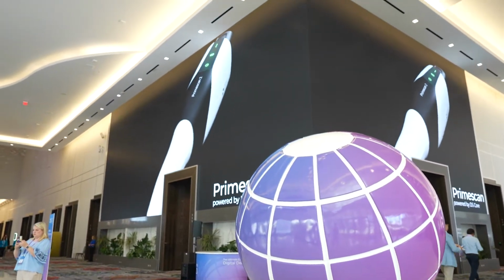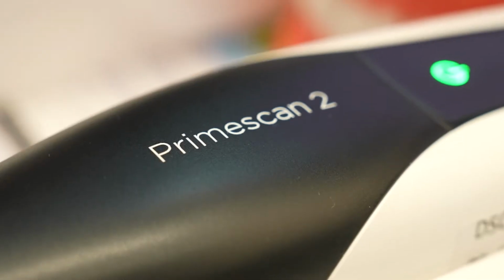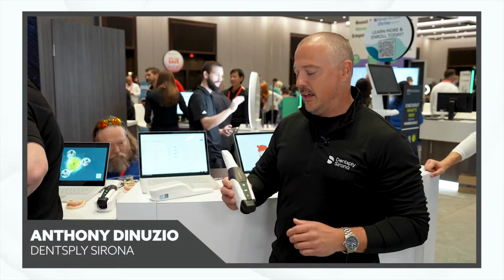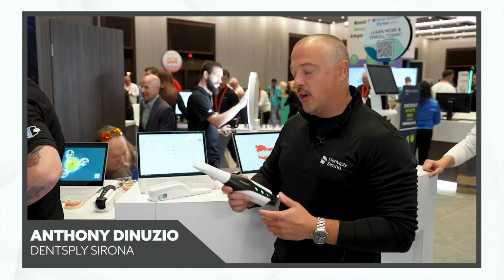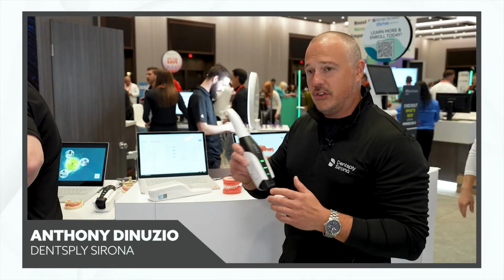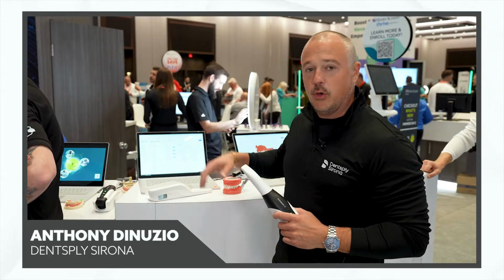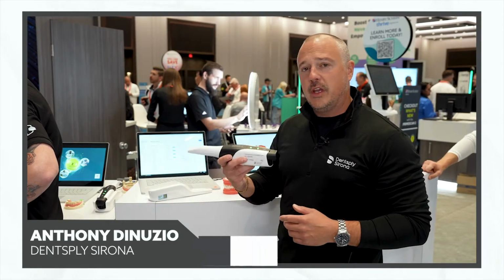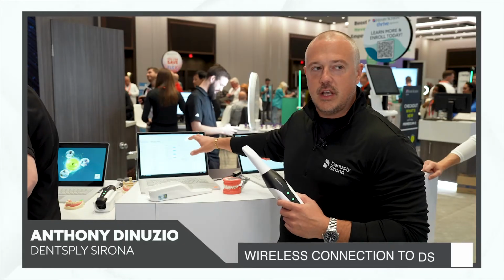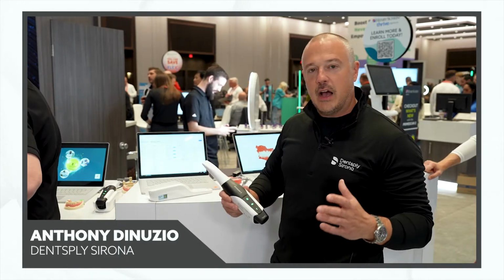Welcome to Dentsply Sirona World 2024, where we are showcasing Primescan 2, our first direct-to-cloud, cloud-native intraoral scanner. I know it might look like, how we have it set up, that this camera and this intraoral scanner is connected to this computer, but it's actually not. All we need is a Wi-Fi signal for Primescan 2 and to be logged into a DS Core account. Let me show you how it works.